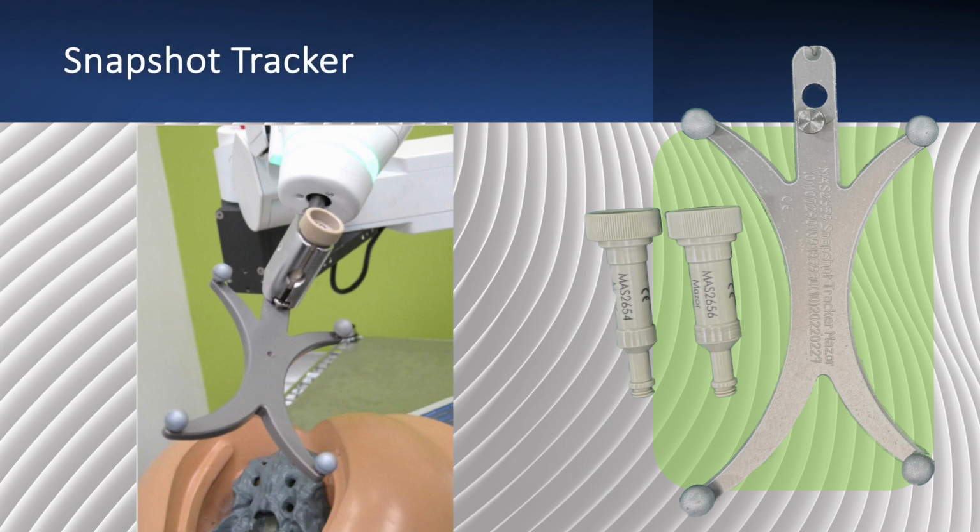Robot navigation system registration involves the use of the snapshot tracker. The snapshot tracker is placed in the surgical arm guide and screwed into position during the robot navigation registration. The system then correlates the position of the reference frame with that of the surgical arm. 4 disposable sterile spheres, recognized by the navigation camera, are attached to the snapshot tracker, 1 on each of the 4 legs.